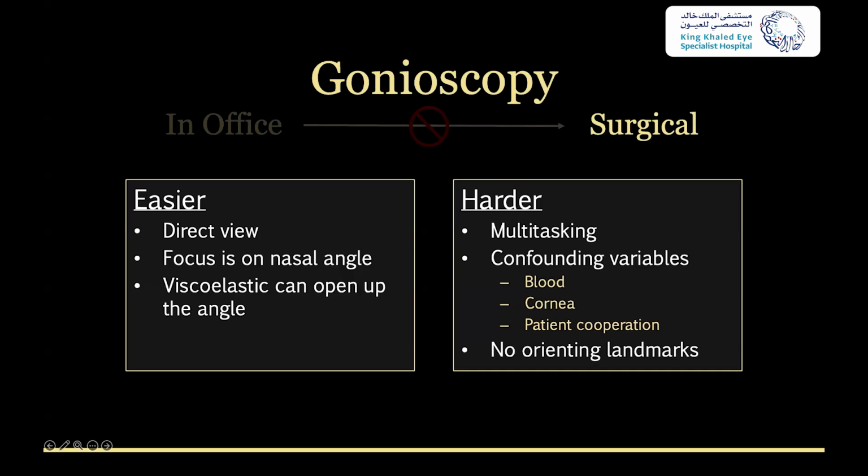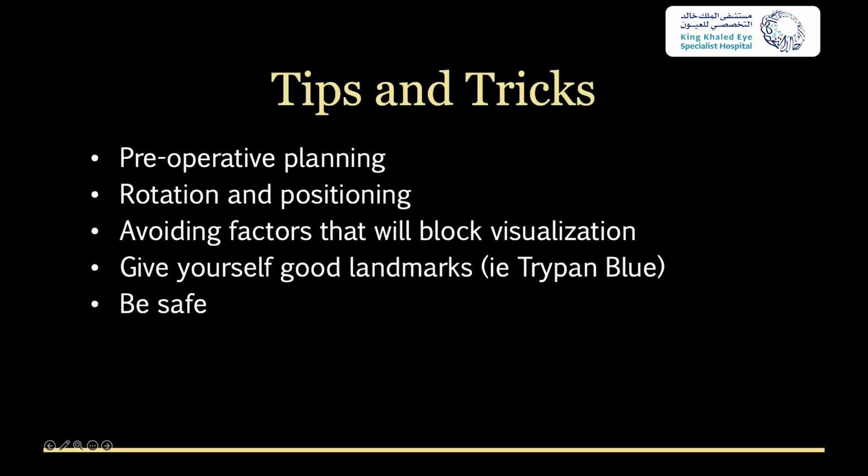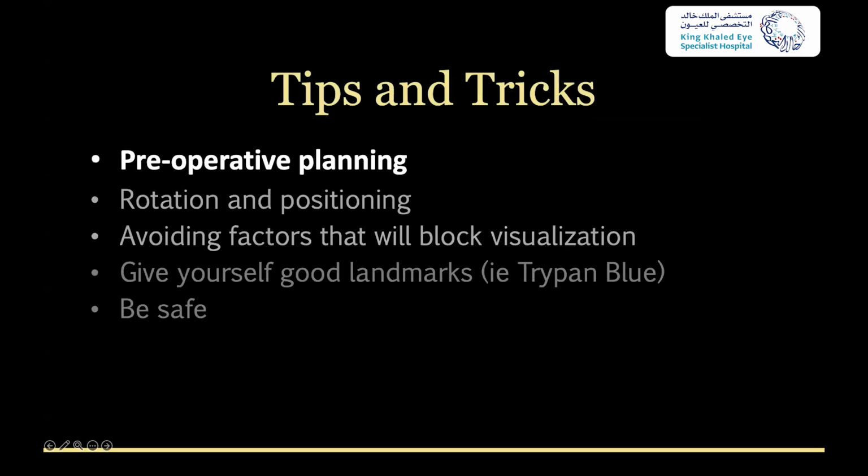The other thing is that there's no orienting landmarks. So some of those tips and tricks that Dr. Allward went through aren't something that you can lean on in the operating room. So I'm going to talk a little bit about tips and tricks, starting with preoperative planning.